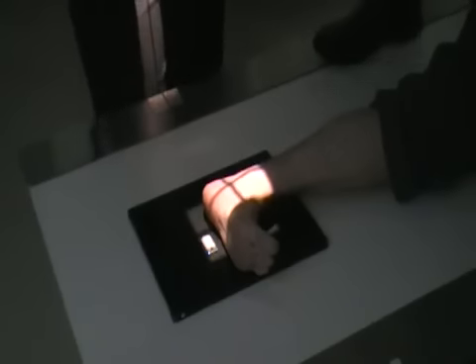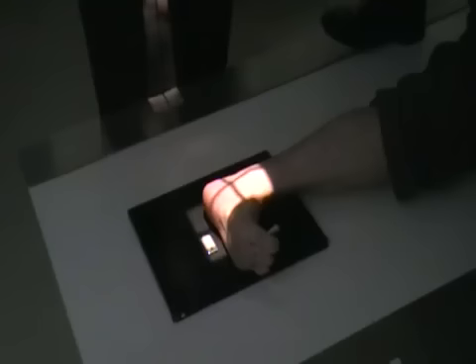Go ahead and have your light above the malleolus here. We want to include the ankle joint as well. So this is our lateral calcaneus.